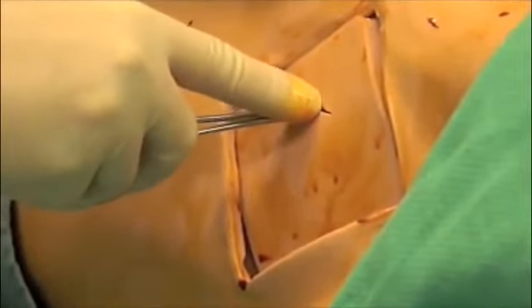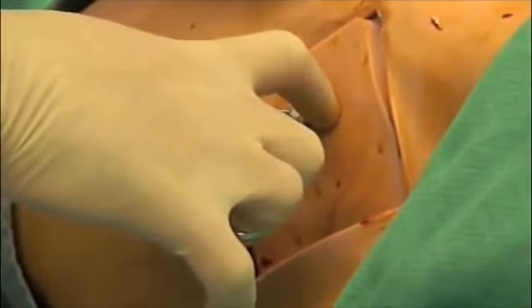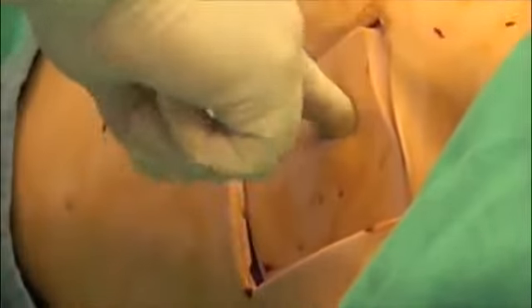Puncture the parietal pleura with the tip of the forceps. This should release a rush of air or fluid. While still within the pleural cavity, spread the forceps widely, then remove.